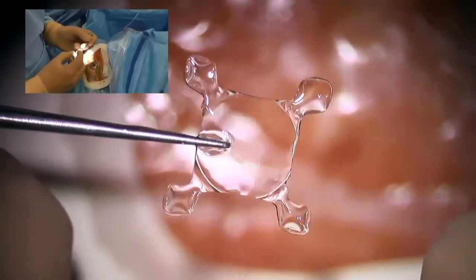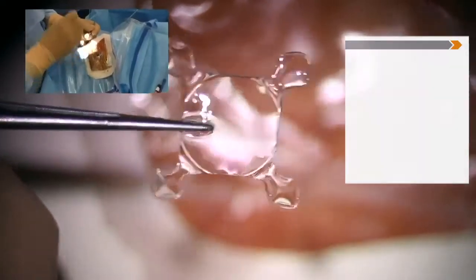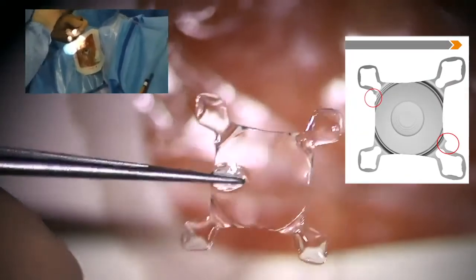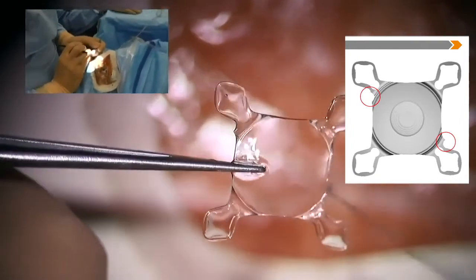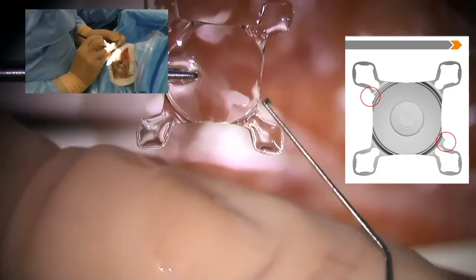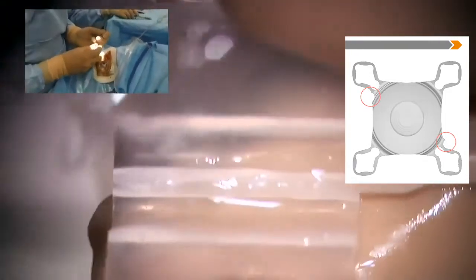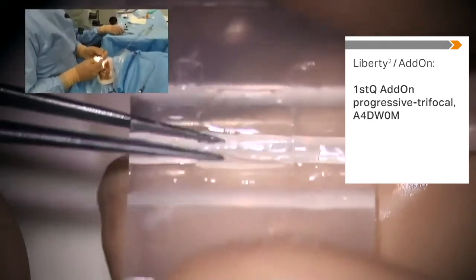So now we are at the implantation side for the add-on IOL. There was a question about the alignment and the way to avoid an upside down implantation. I would like to show you the lens. You see here the 6-ring diffractive array probably. You see the haptics, and you see, give me the push-pull. You see here a slight edge here, and there is a half circle in this part of the lens, and this helps me to identify the back face and the surface of the lens properly to avoid an upside down implantation.